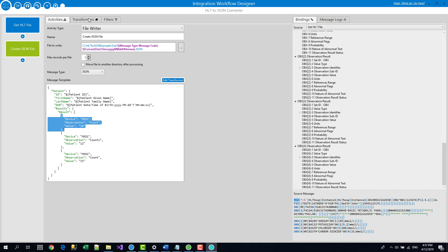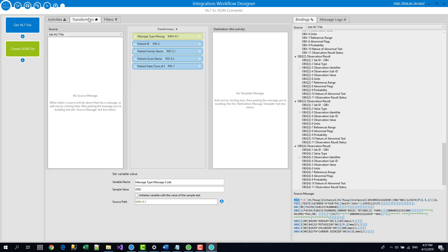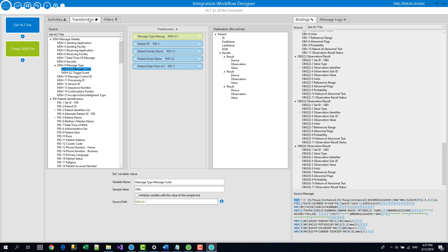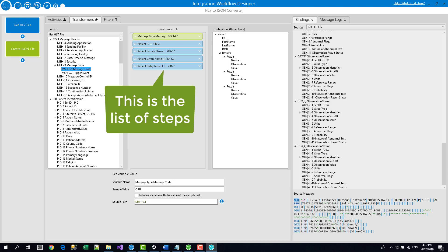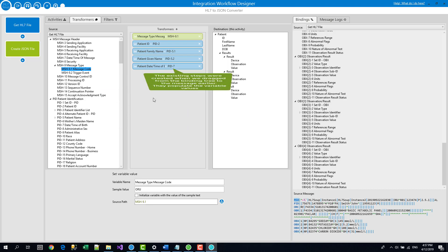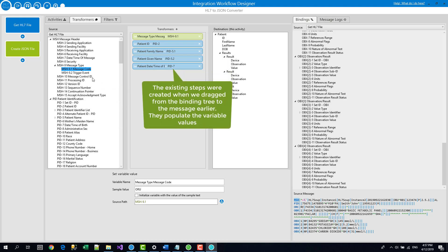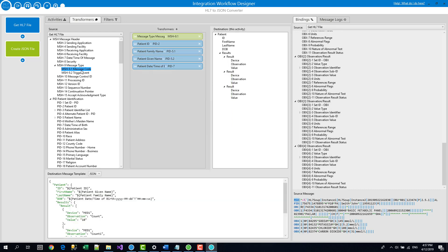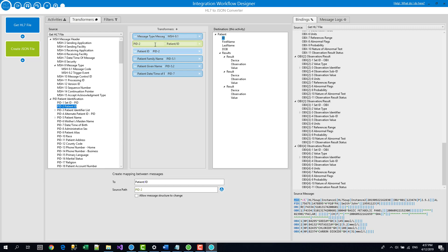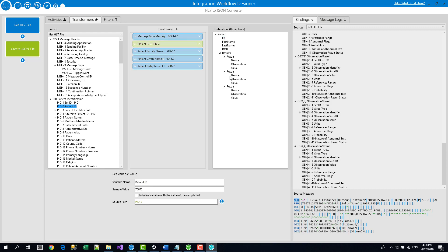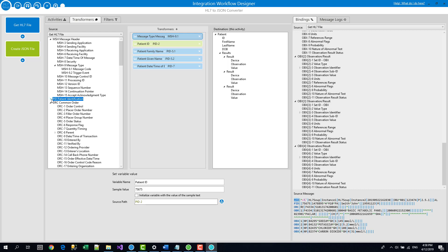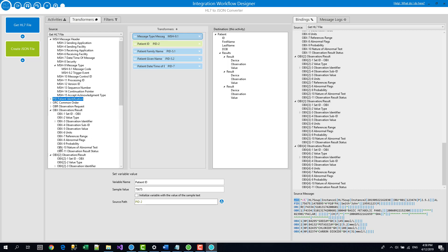And now we're going to head into what's called the transformers. So transformers are basically the steps to convert from one message type to another. And on this left hand panel, we've got all the source conversions, the source values. On the right hand panel, we've got the destination message. We could have actually done the mappings earlier in here. We could just take the patient ID and drag it to the patient ID in that message. And it creates a binding between those two. But we're not going to use that technique because of the complexities I'm about to show you.